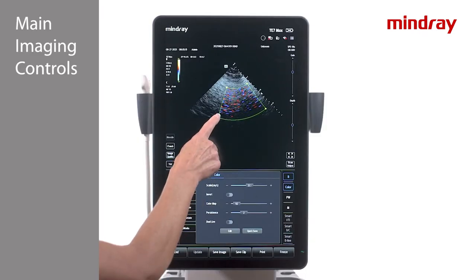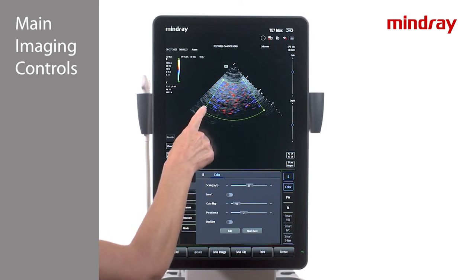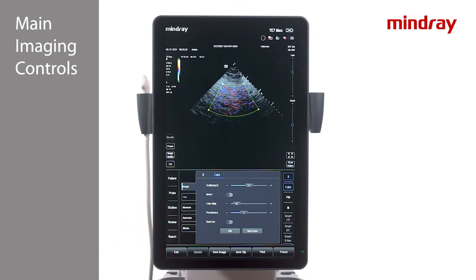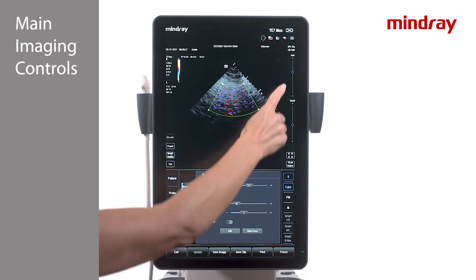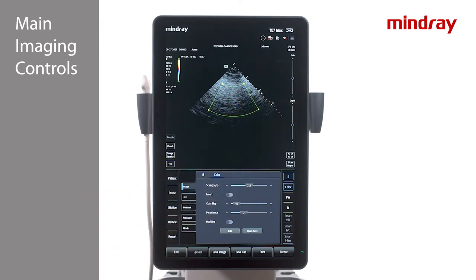To change the size of the color box, tap and drag one of the dots in the corner of the color box. To change the position of the box, press a finger in the middle of the box and drag it around the image. Notice, while in color mode, the gain works to increase and decrease your color gain.